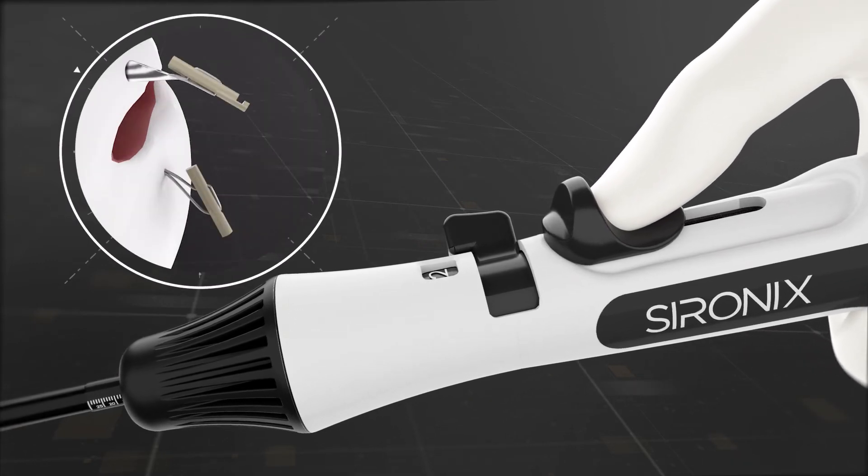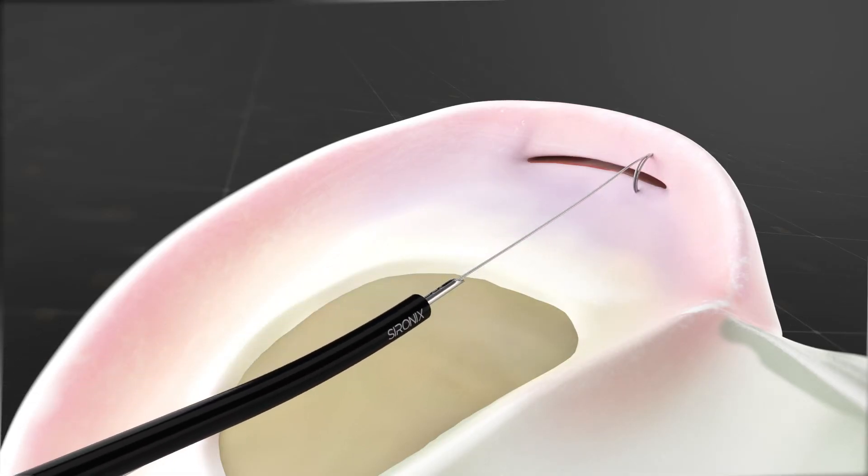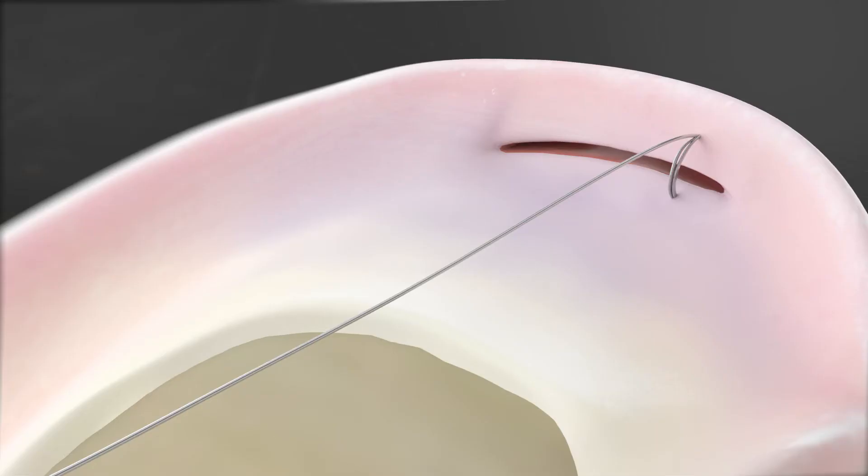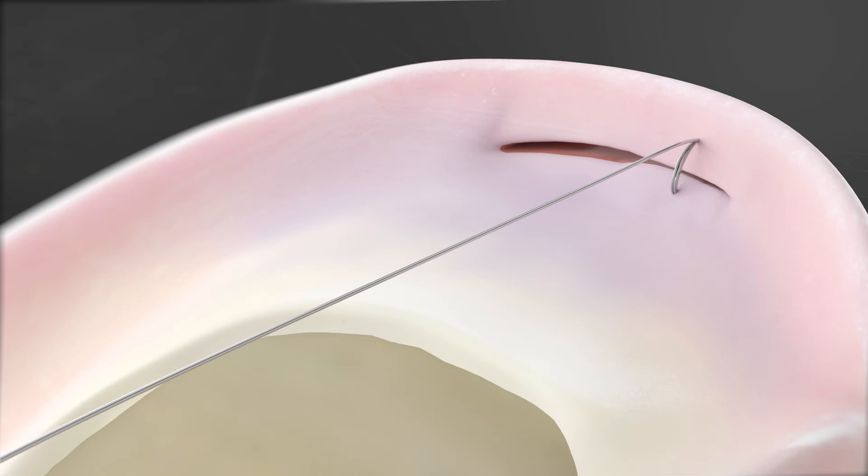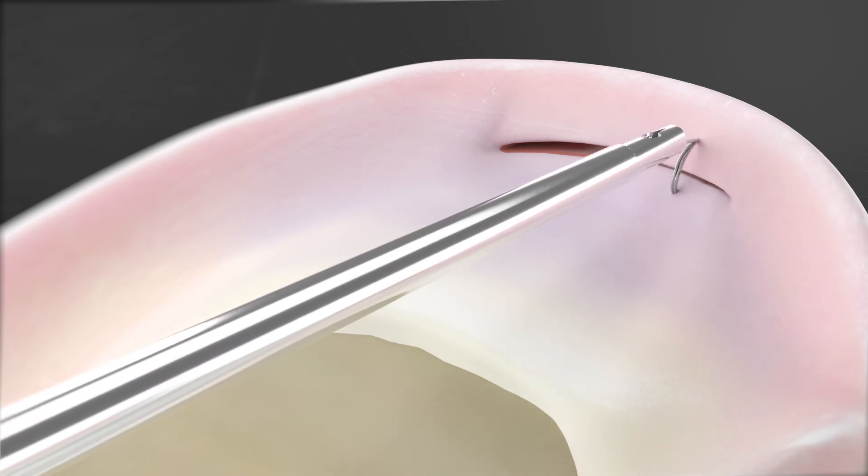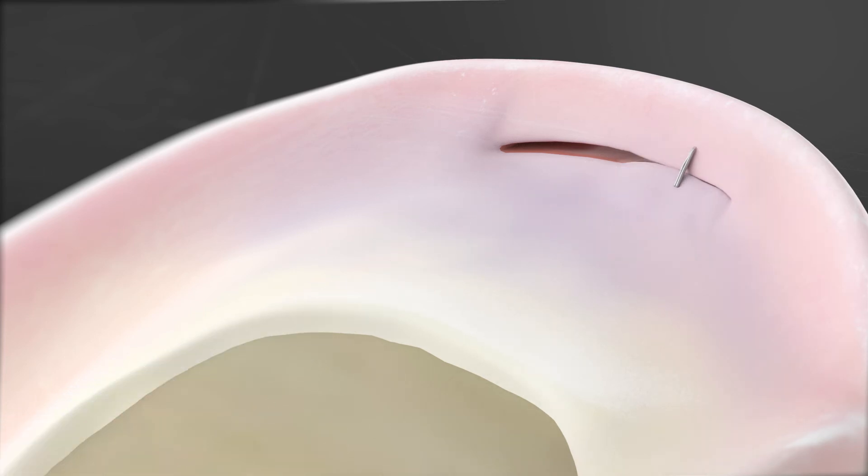Carefully retract the Sironix SureStitch from the operating field. Use the Sironix Knot Pusher to pull the suture tail with consistent tension until the desired approximation of meniscus is achieved. Then cut the remaining suture tail.